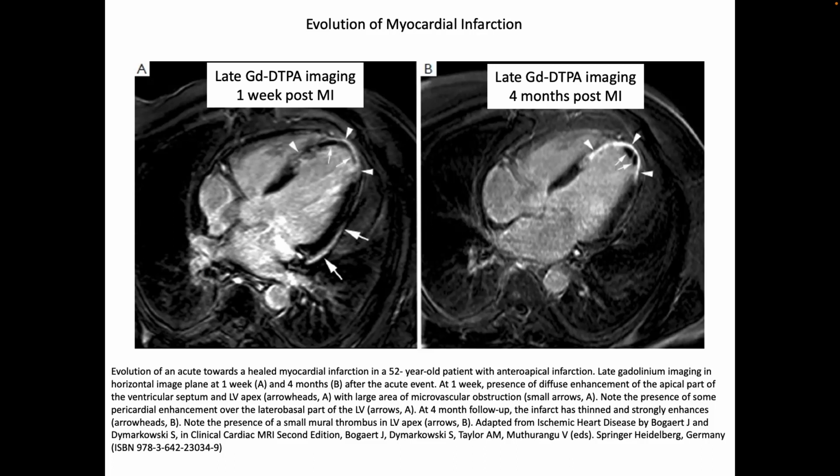So it's like you've plugged up all of the small vessels with hemorrhagic, clotted blood, right? And so when you see this on a late gadolinium enhancement, and you can see there's a real dark band there, usually the tissue is still at its original geometric width, but there's a chunk of it that isn't getting blood flow. It's just filled with crap. And then this stuff is getting blood flow, but it's enhanced, and so it's highly likely it's infarcted.